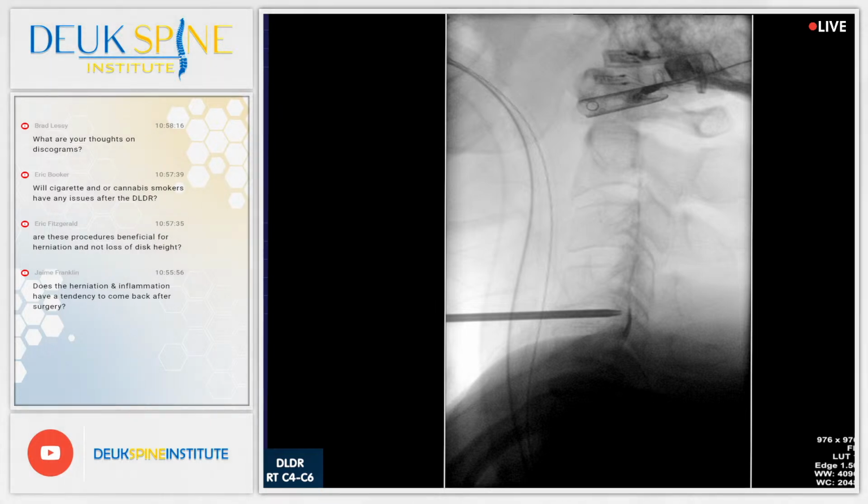4-5. Shot. Now, when I look at the end plates of 5-6, the end plates of 5-6 show bone spurs in the front, and I would think 5-6 was injured the longest, but there's a lot of scar tissue in this disc. I can already tell, just by the feel.